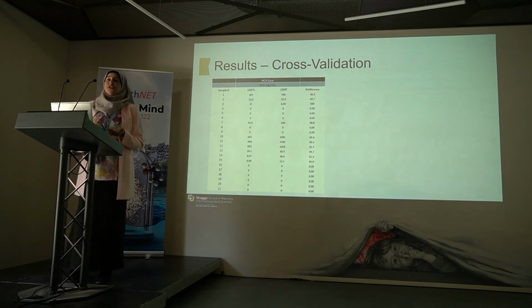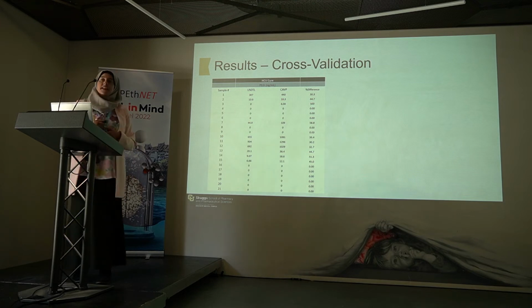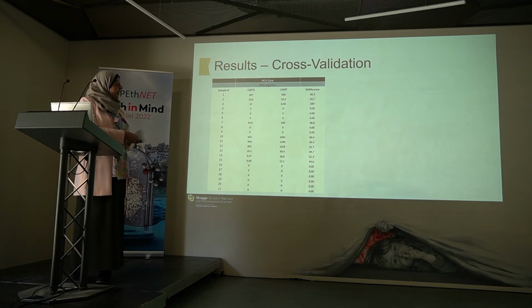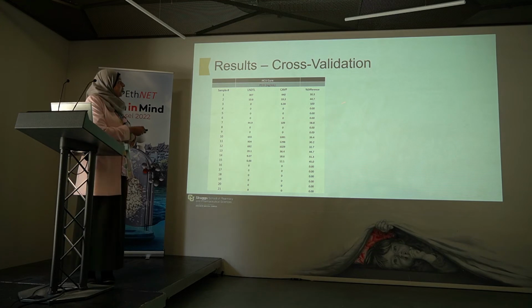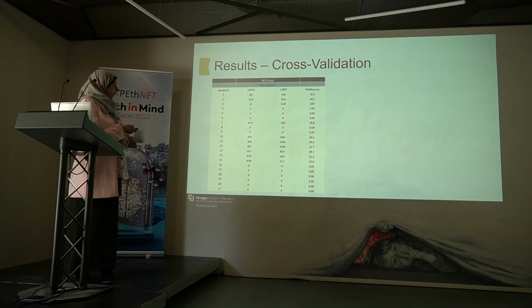So to answer that question, we looked at the percent differences in PEth concentrations per sample. And here I'm just showing the HCV Cure data, but know that the ADEPT data looked almost identical. So when we compare the USDTL's concentrations with ours, and we look at those percent differences, you see a lot of zeros in this last column. These are from samples that we both identified as BLQ. In addition, there is a 100% different sample, and this is from a sample that we quantified at 6 nanograms per mil that was BLQ for the USDTL.